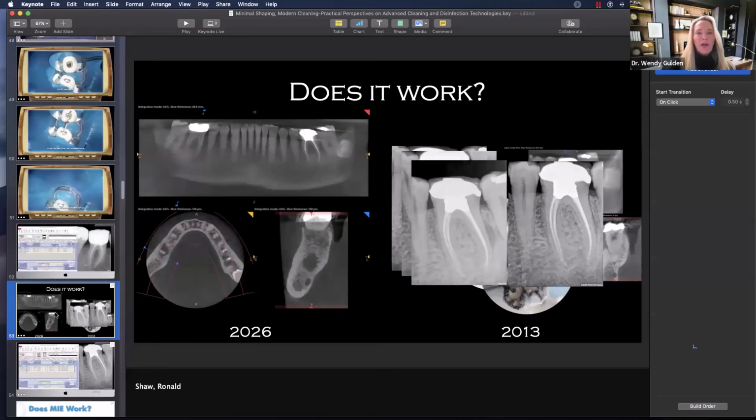John, what sealer are you using in your cases? Oh my goodness, I've forgotten now. So we started with the Buchanan labeled the red Brasseler BCS. We changed to Angelus, and it's a single part BC sealer system. You can't use a 2-part because you just can't deliver it. On that last case, a question came in.